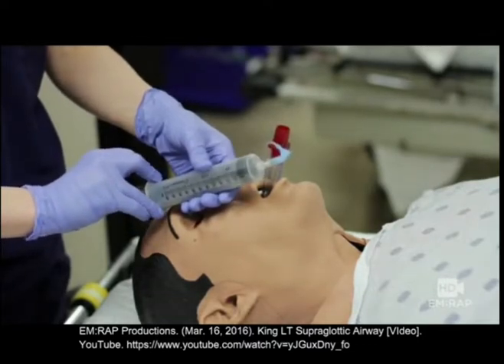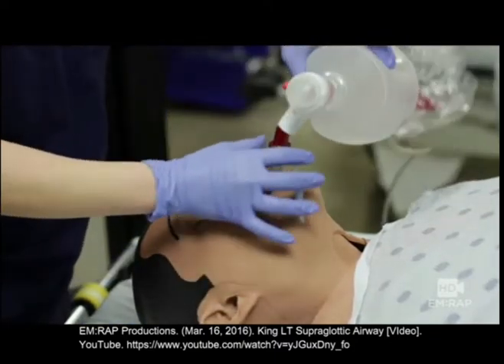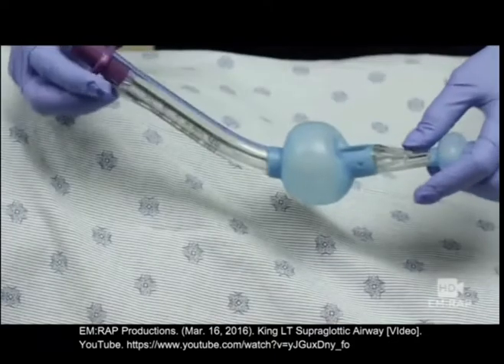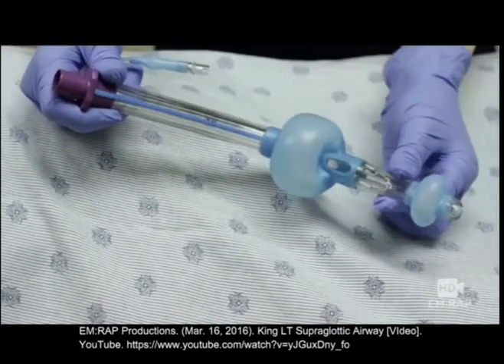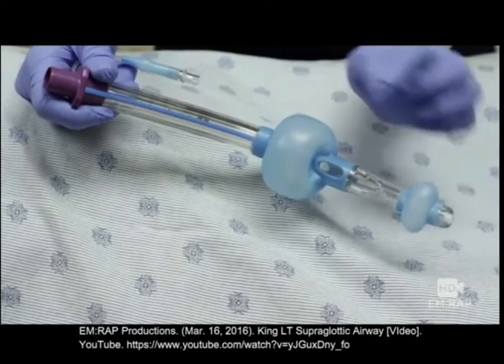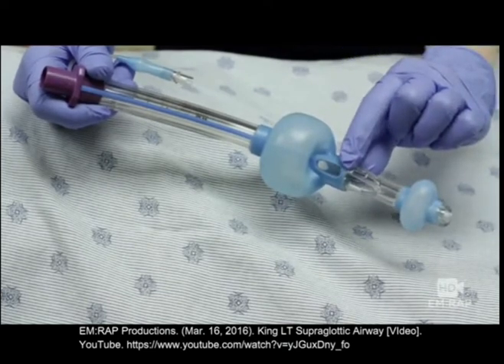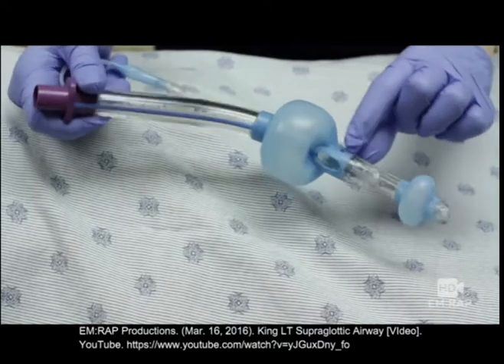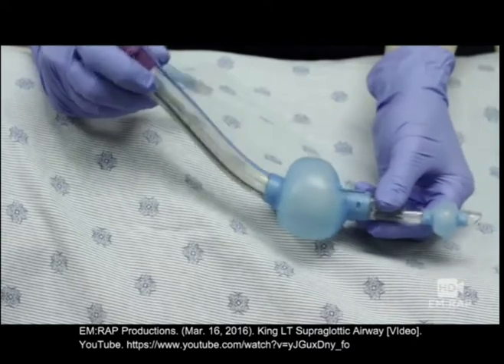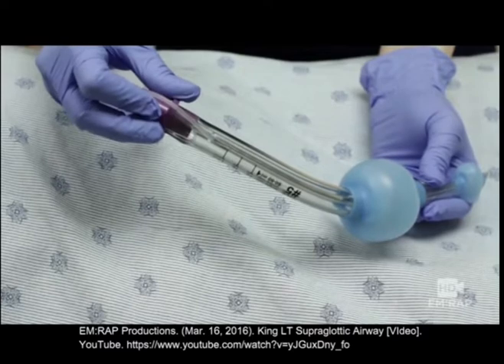Now you should be able to bag your patient. If you have any resistance to bagging, you want to back it out just a little bit till you get the ventilatory openings right at the glottis. Now there are 2 balloons. The more distal balloon goes into the esophagus. It's an esophageal intubation. And the more proximal balloon goes in the hypopharynx. There's 2 main ventilatory outlets, and there are 2 side eyelets, one on each side. There's also a gastric port, which is made to be able to pass up to a size 18 French gastric tube right there on the side.